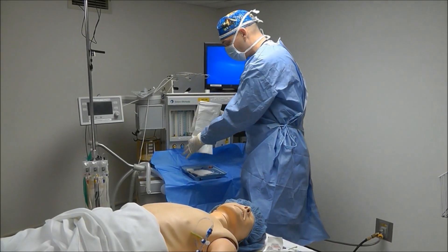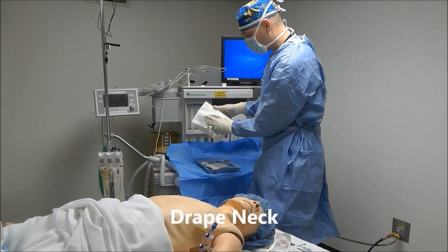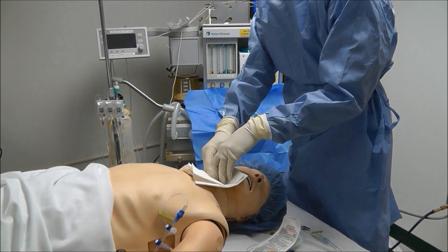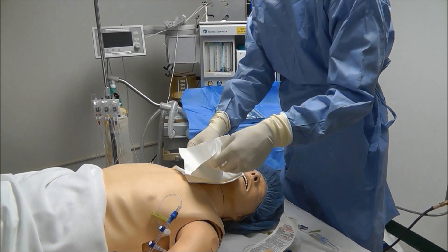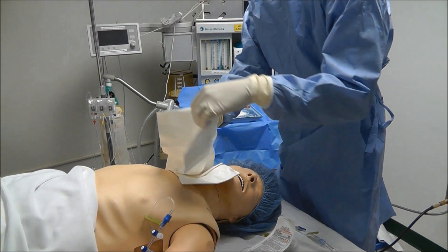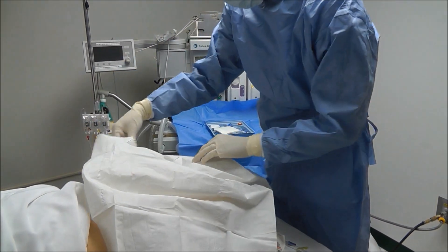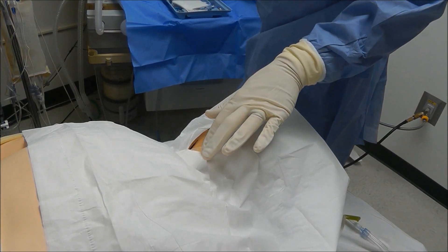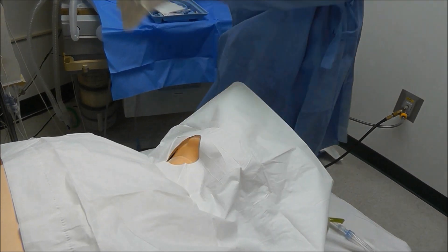The first thing I'm going to do is drape the neck. You've got this little circle here — that circle is going to go on the point where I'm going to insert the line. Now that the patient's neck is draped, it's time to do a full body drape.